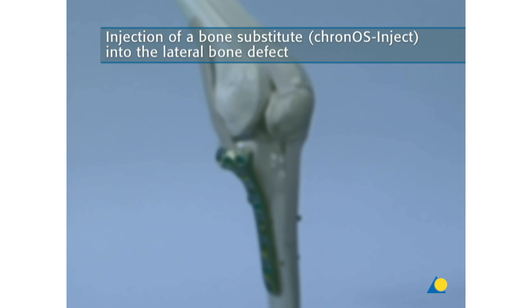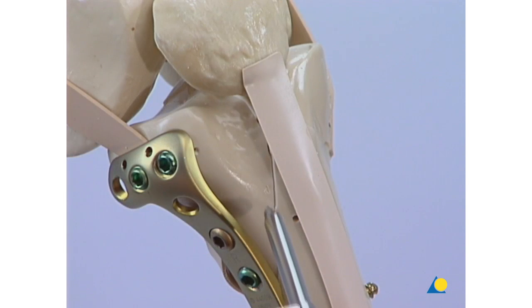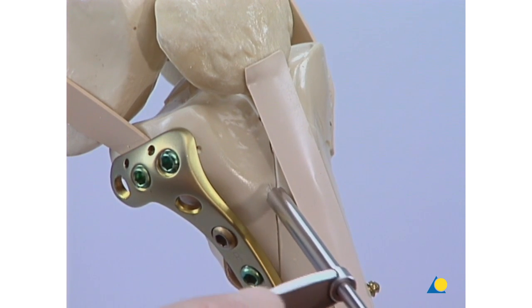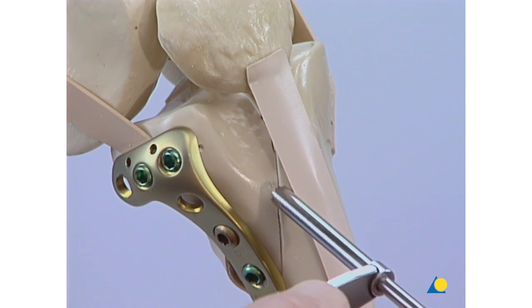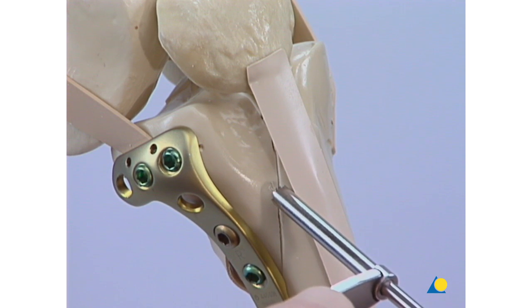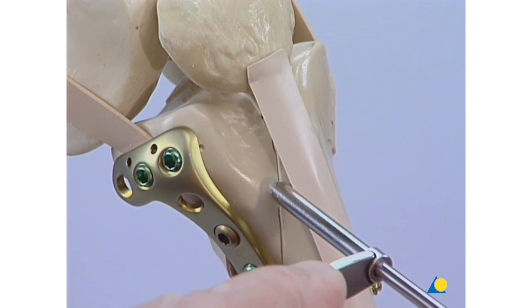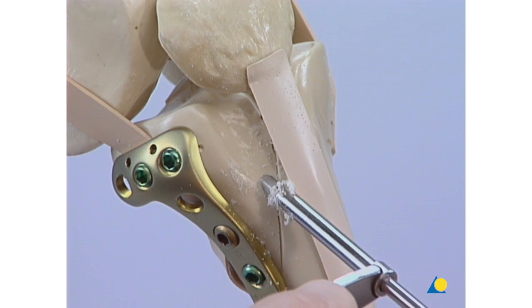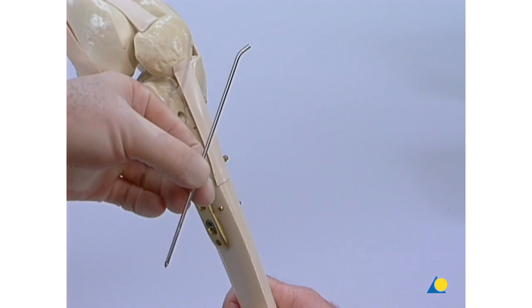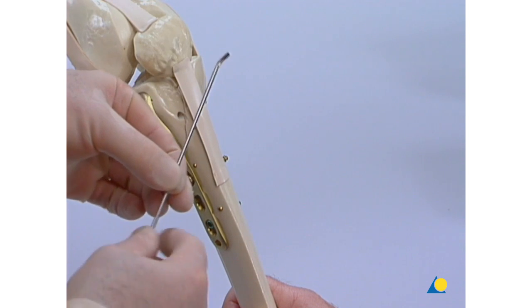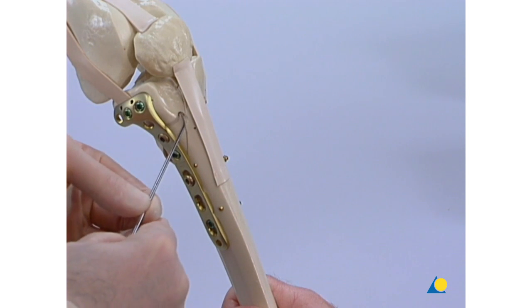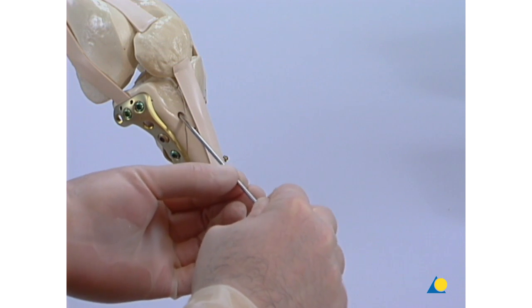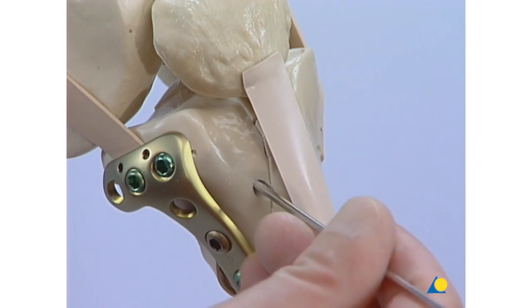Injection of a bone substitute, chronOS Inject, into the lateral bone defect. A hole is drilled in the anterior cortex using a 4.5 millimeter drill. A probe is inserted into the bone defect and used to impact the bone debris to create a single space for the introduction of the chronOS Inject.